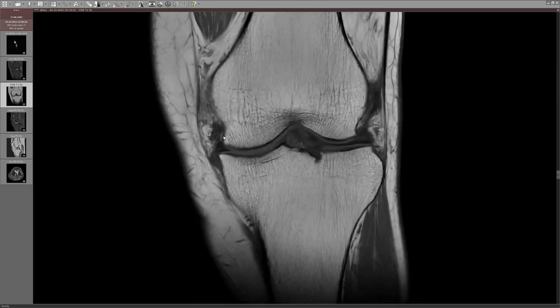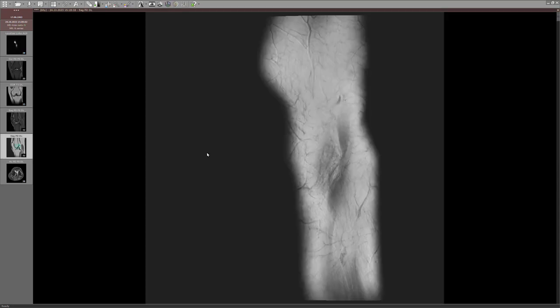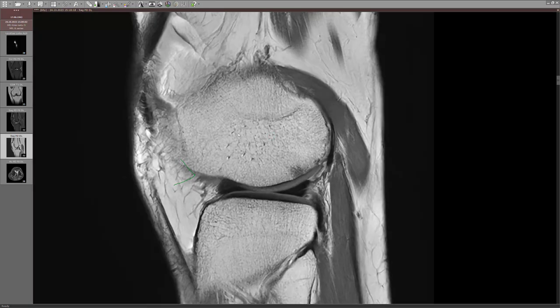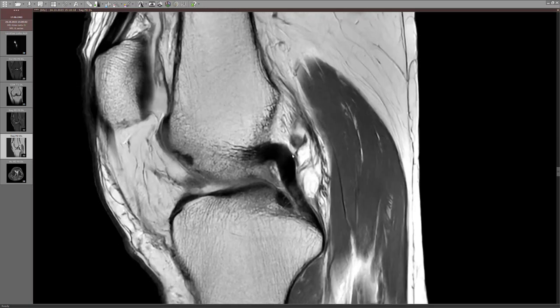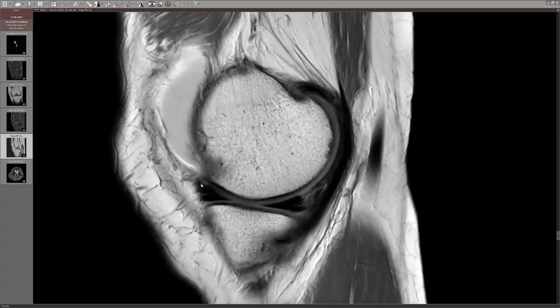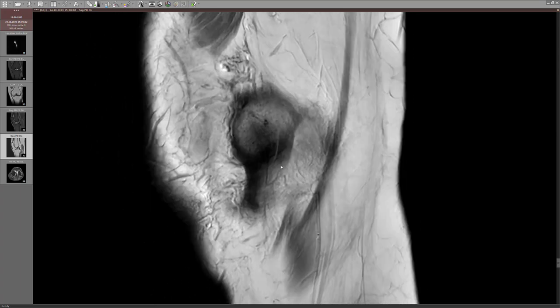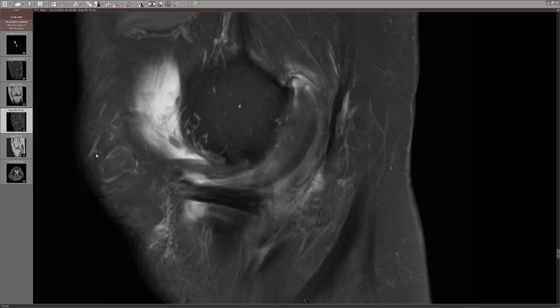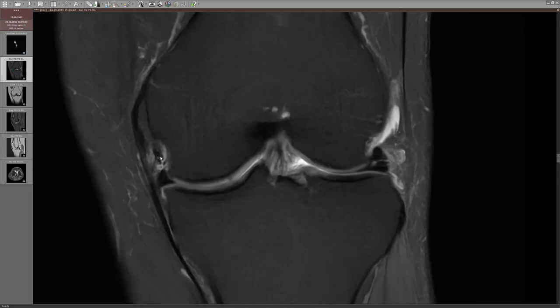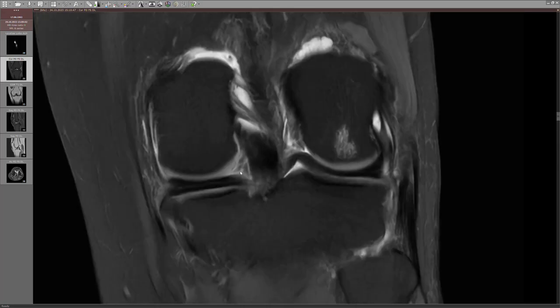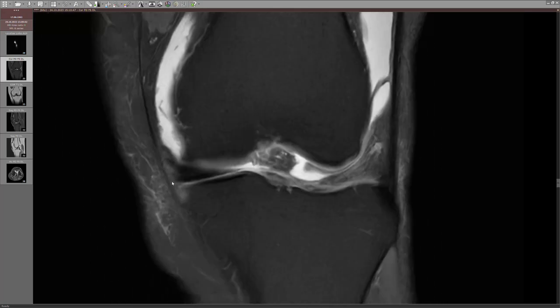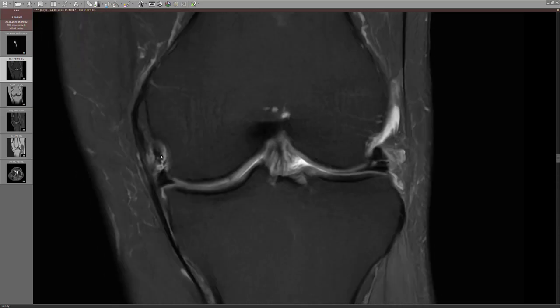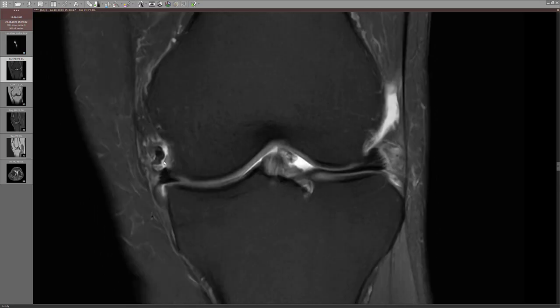On the sagittal PD, we can see it going down obliquely, though slice thickness limits visibility here. The axial and coronal images are the best sequences. We should not mistake this for displaced meniscus, because there are no missing pieces — it's not a flap, not a fragment, not an osteochondral body. It's a capsular, fascicular capsulofemoral band.